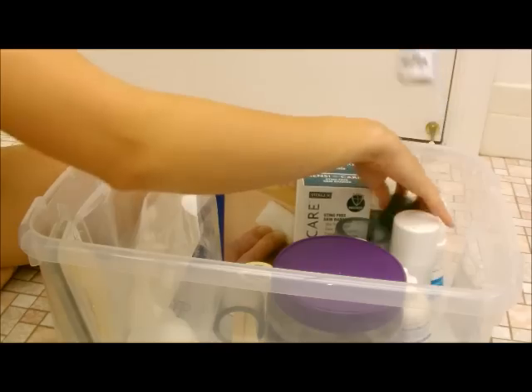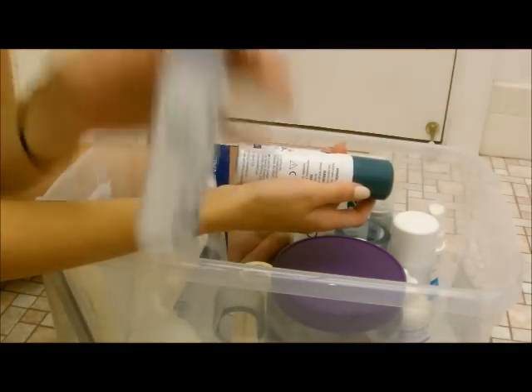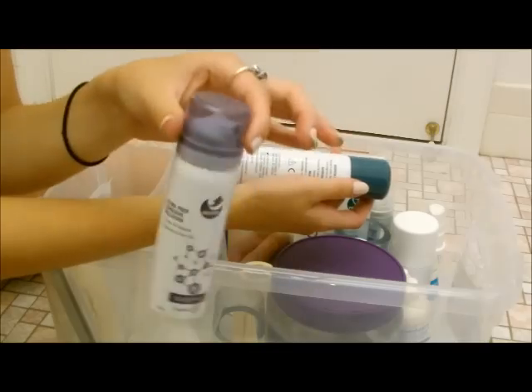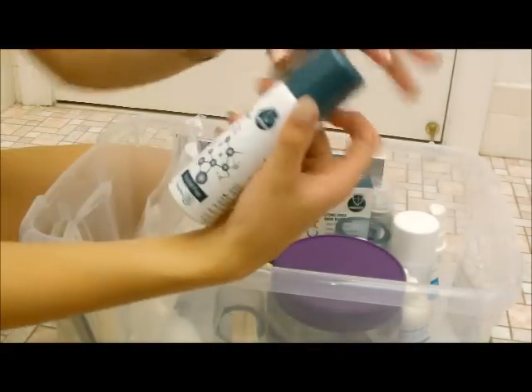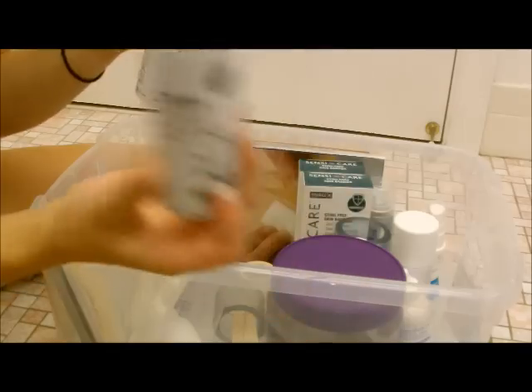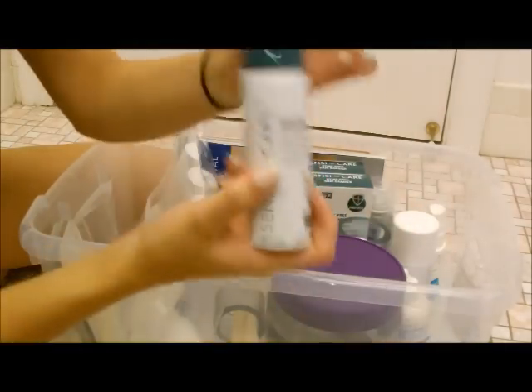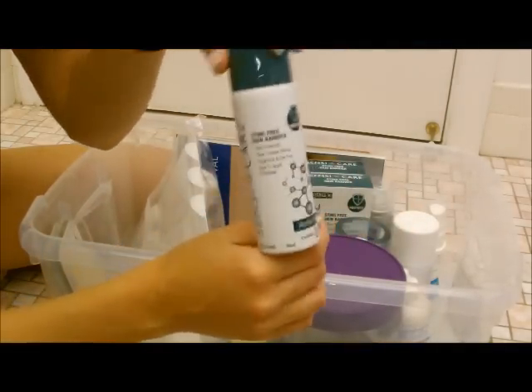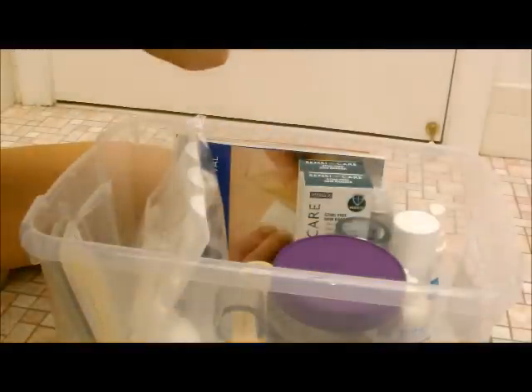So you have the wipes, and then they have the same product in sprays. I have the SensiCare adhesive releaser, which you spray around the adhesive on the bag, and it makes it fall off, basically. It's a really cool concept. And then they have spray skin barrier. I'm starting to like the skin barrier spray now, because I'm realizing it puts a thicker layer on your skin than the wipes.